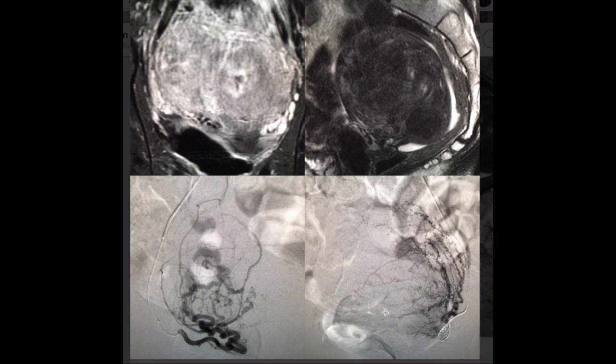This was done from a pinhole in the wrist, and using the embospheres, which I showed earlier, we cut off the blood supply to this fibroid uterus, and the patient's bleeding and symptoms resolve very, very quickly as the tumors shrink over time from lack of oxygen and other nutrients that are within the blood.